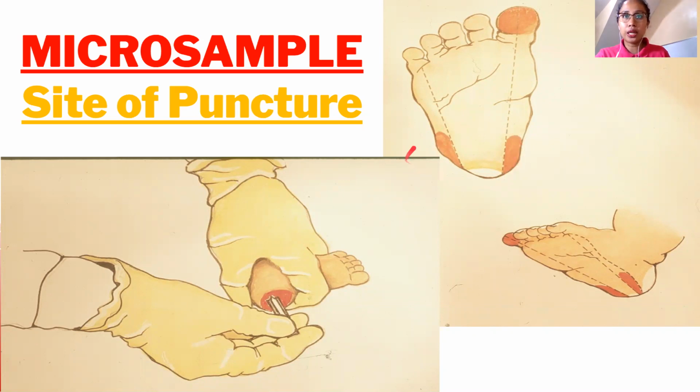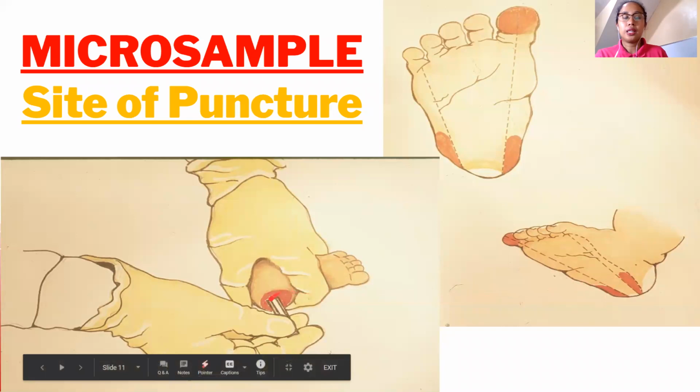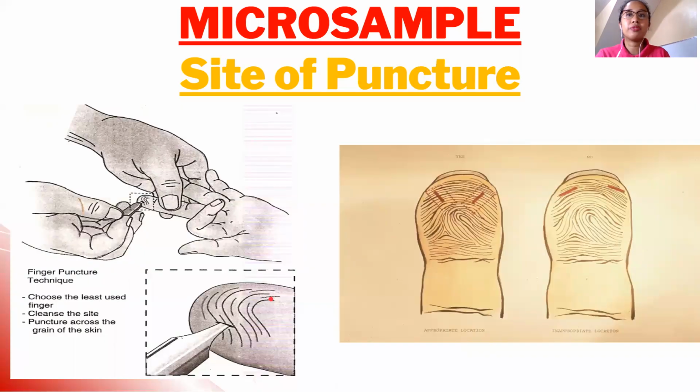Ang suggest ko na lang, class, lagi ng lateral. So, lateral is away from the midline. Pero sabi niya medial or lateral. Pero kung ako sa inyo, lateral na lang. So, dito, yung mga highlighted area. So, heel, pag infant.